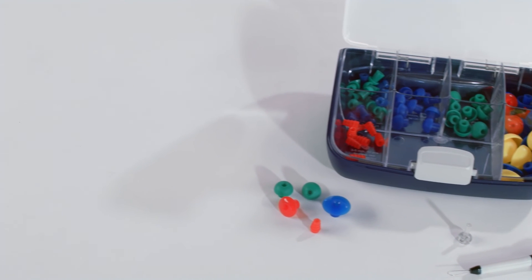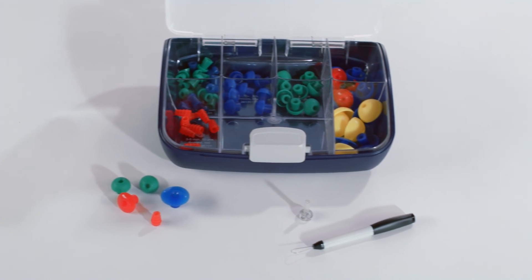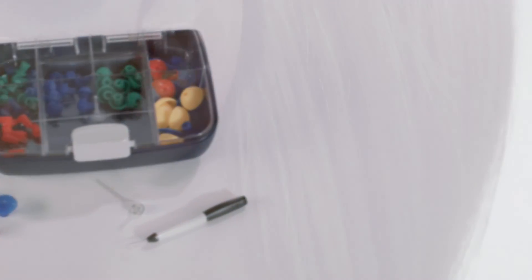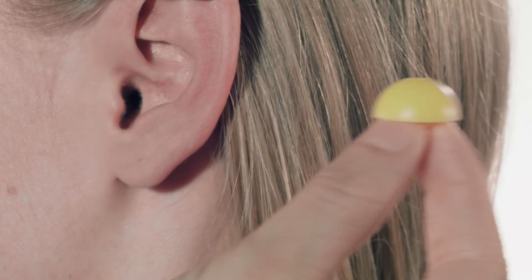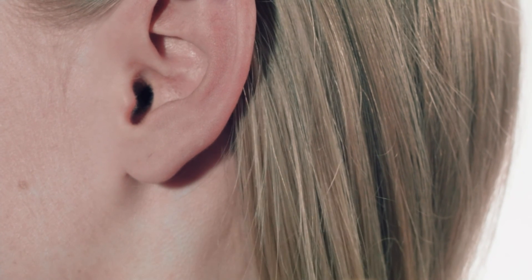The selection of the appropriate ear tip is necessary for the measurement to be completed. Within the included ear tip box, there are multiple sizes for selection as well as two distinct shapes.